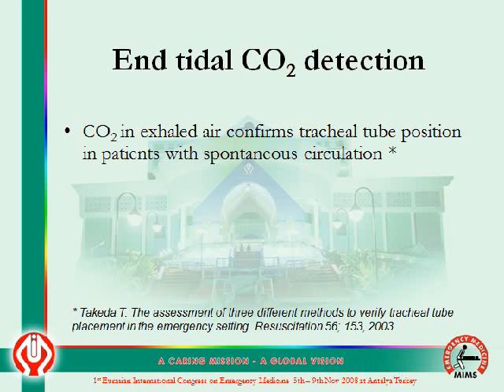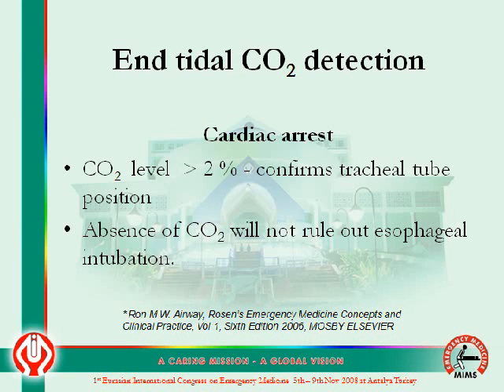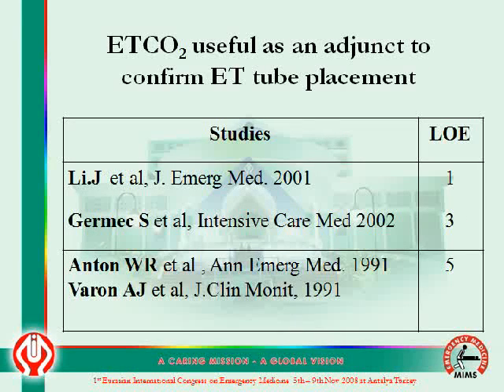Then what about patients with cardiac arrest, where apparently there is no spontaneous circulation? There also, a level of carbon dioxide more than 2% will confirm the tube position. But remember, the absence of carbon dioxide will not rule out esophageal intubation.